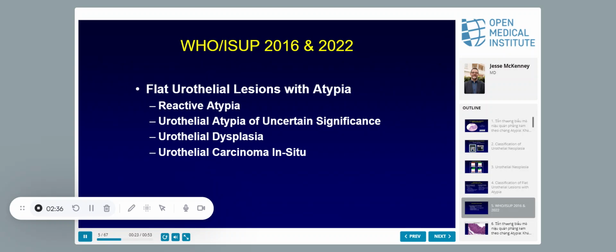So the main goal of this talk, the two things you need to learn, is what's your low threshold for carcinoma in situ, like what's the lowest atypia that you can have to call carcinoma in situ, and what's the highest amount of atypia that you can have to just call definitely benign reactive. And then you don't need to worry so much about the things in between. You're wasting your time because they're unresolvable, and I'll tell you the easy way to deal with that.